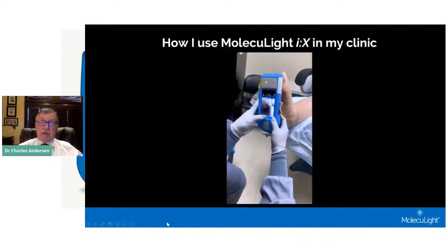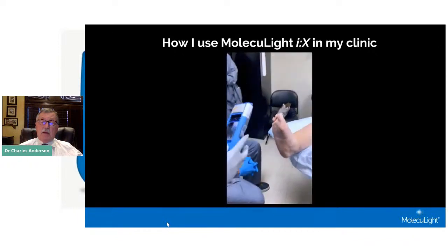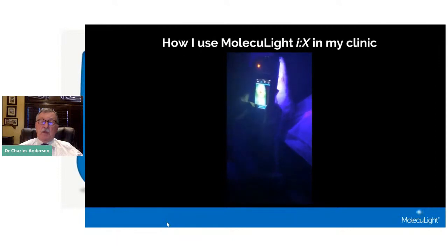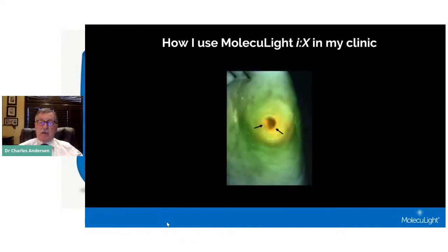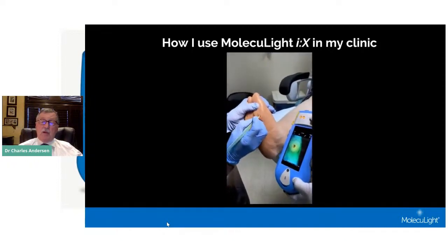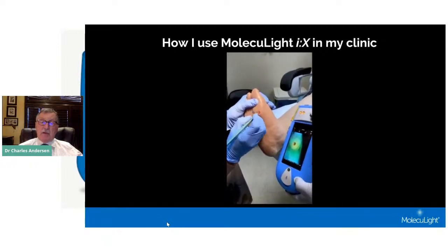So here we are in the clinic. We're obtaining our initial image. Then when you're doing the fluorescent part of the study, that is the actual bacteria, the lights are off and you're able to then scan that wound. And what we saw in the scan was that there was bacteria.